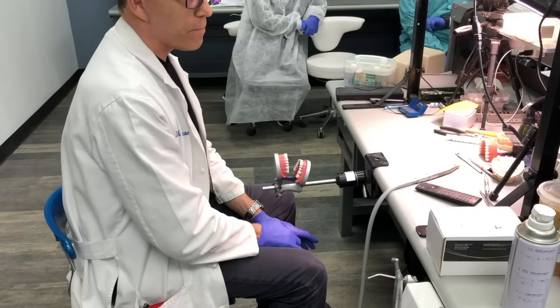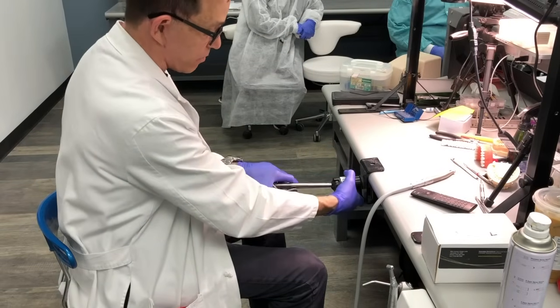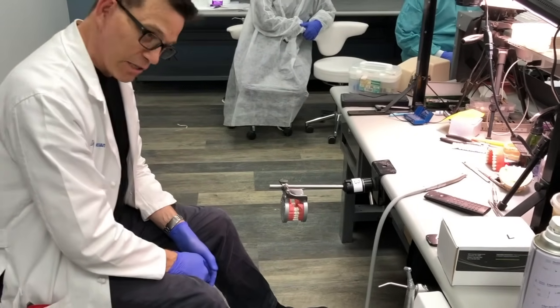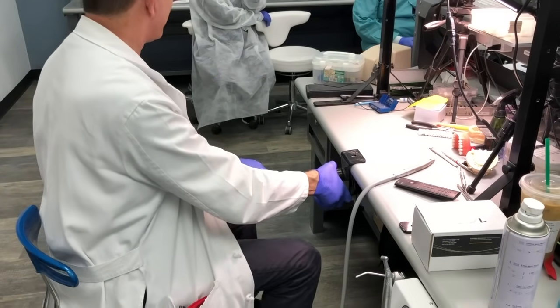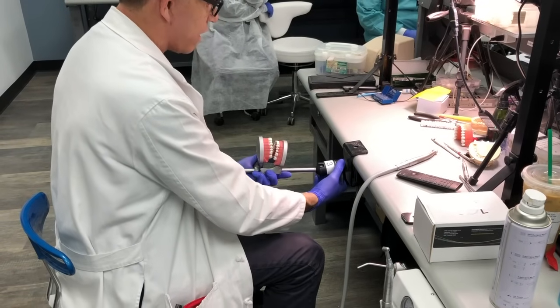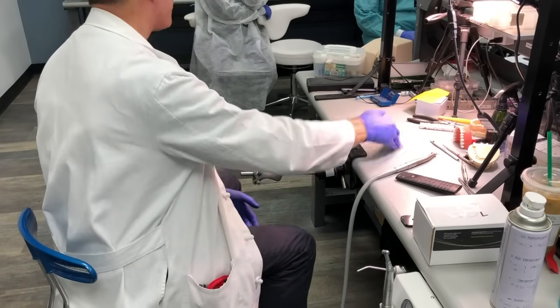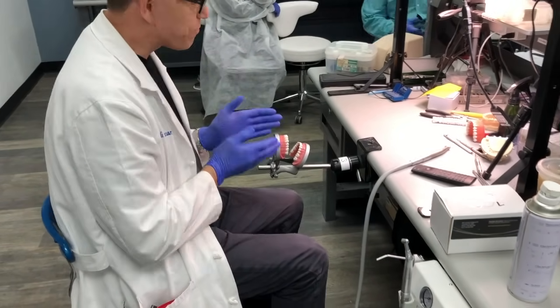With the patient fully back, that's the supine position. If the patient were facing straight down, that would be the prone position — we don't do dentistry in the prone position. The other position we don't use is 6 o'clock, because that would require you to straddle the patient. So remember that all working positions are on this side of the clock.